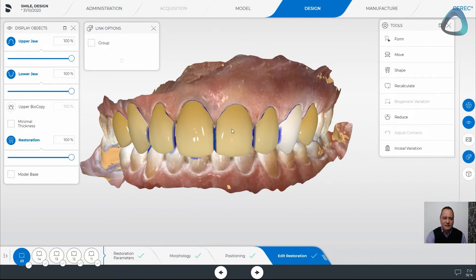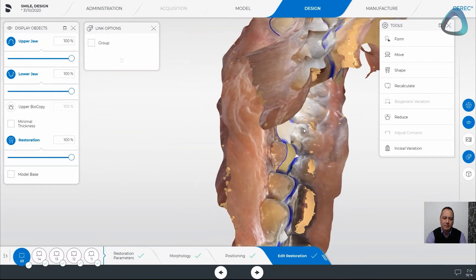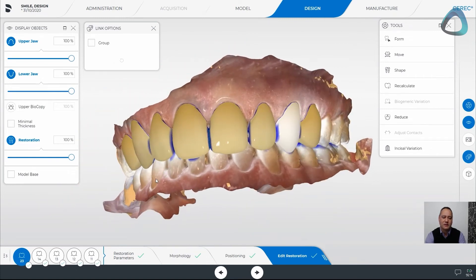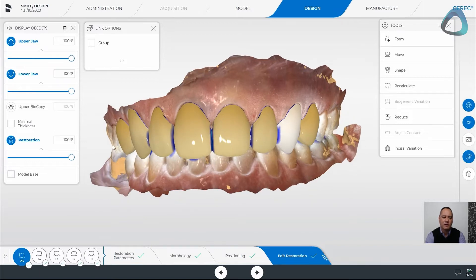In this particular design we've got a whole bunch of anteriors that we've designed for a patient, and we've even extended this into the region of the fours so we don't see black triangles coming through. It's always good when doing a full mouth smile in the front to include the fours so we don't create dark areas from the overlays.